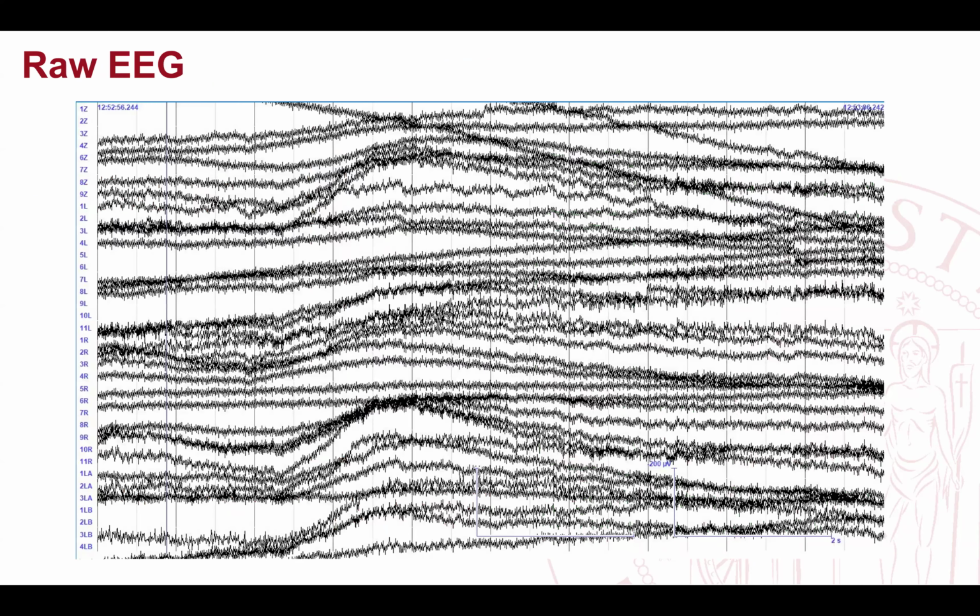At the very end, this is what the EEG signal actually looks like. What I showed you before is the ideal case that I just manually drew, what I expect to have, but things are not that easy. A real EEG signal is something like this, in which you normally have a lot of EEG channels because you want to cover all of your brain, and all of these channels produce this very noisy activity, whose oscillations have a tiny amplitude.